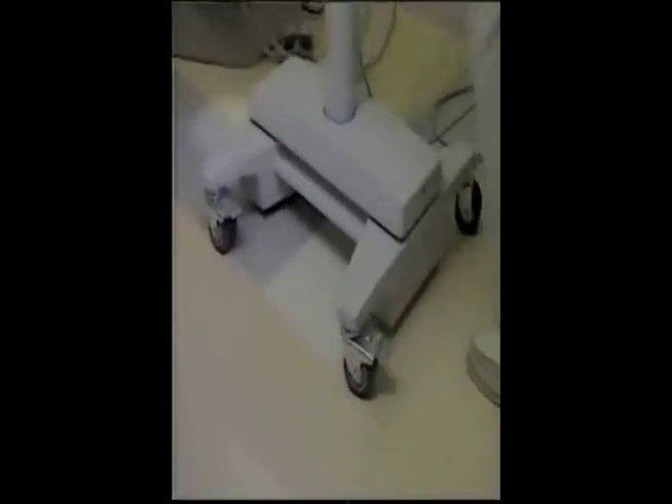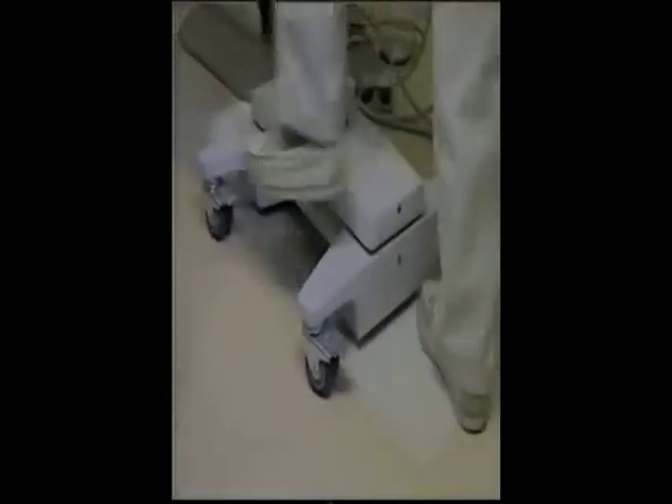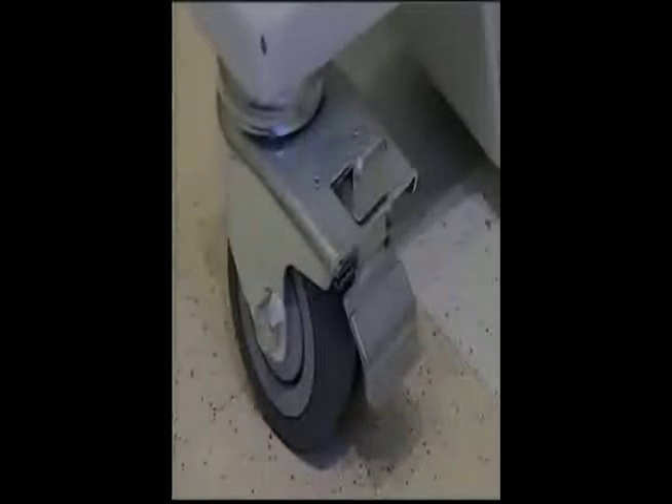The Universa 300 mounts on a sturdy base with casters for easy movement, as well as wheel locks for securing the microscope in place. Depending on your preference, optional wall mounts or ceiling mounts are also available.